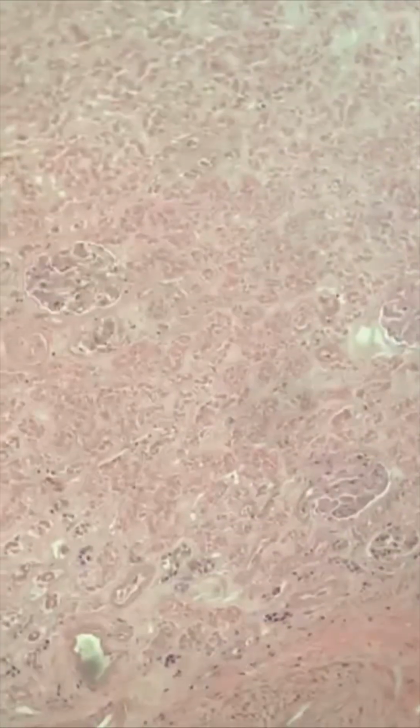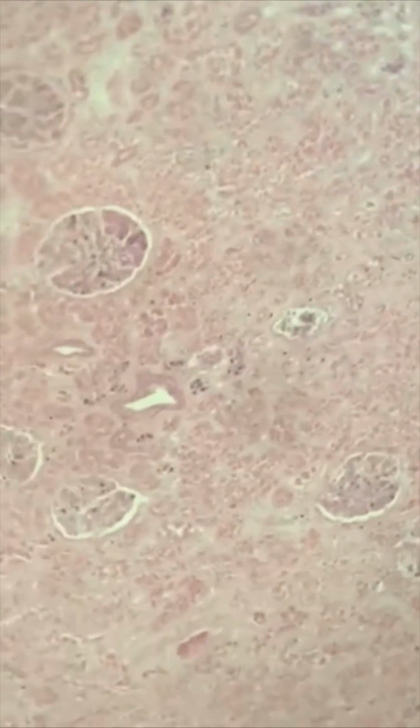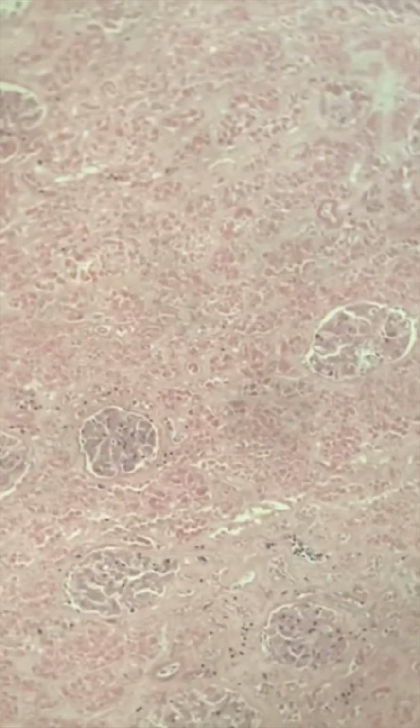You can see the glomeruli are intact. You can see the vessels are good. There's no kidney disease here whatsoever, other than acute tubular necrosis from, again, cardiogenic collapse, cardiorespiratory collapse. We'll go to the next slide.